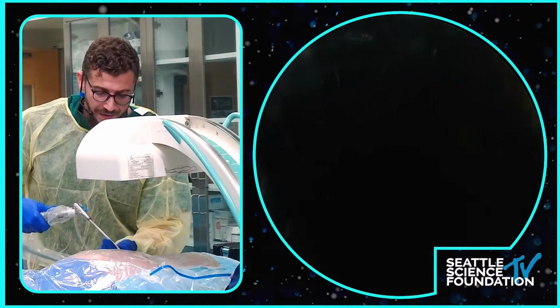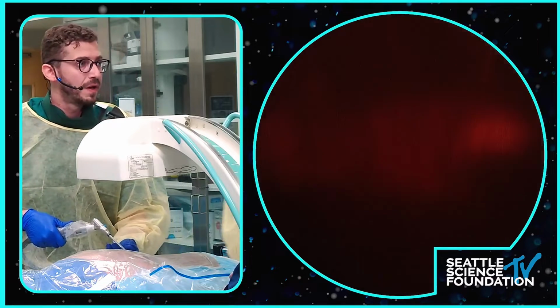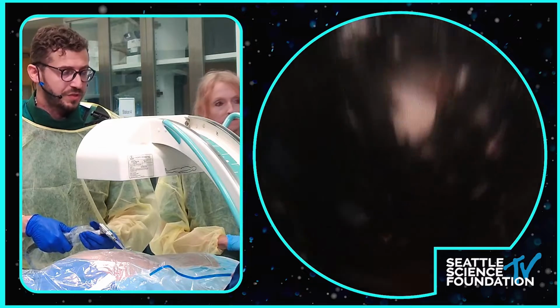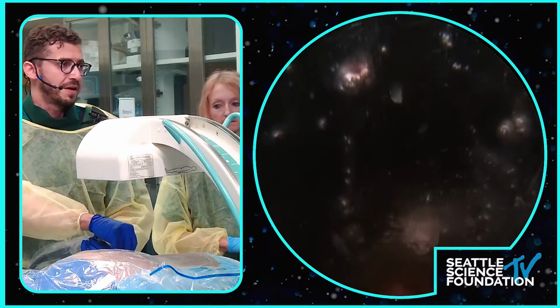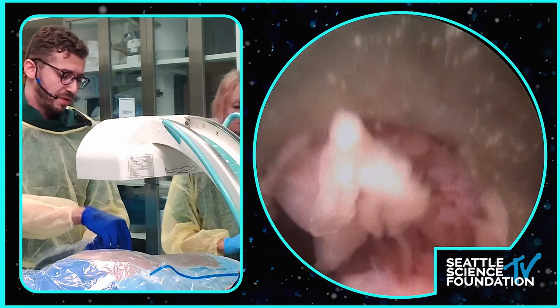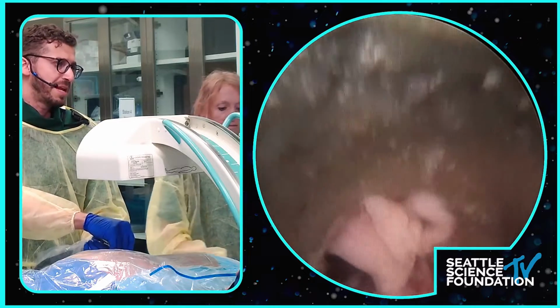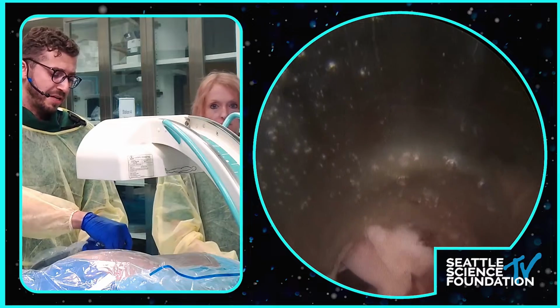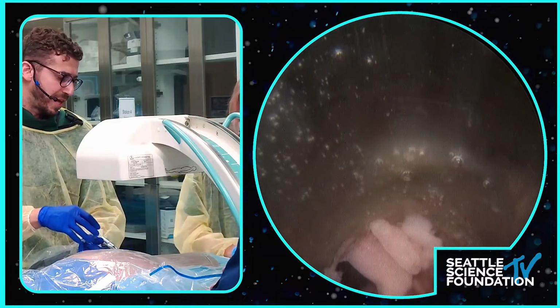While Osama is talking, I think my landmark is I use a posterior spinous process and facet, and then kind of the same thing. As you're putting in the scope in here, you want to hold the working channel down with your index finger. There are many ways of doing this, but that's the way that I do it. I hold the working channel down with my index finger, and I hold the endoscope like a gun.